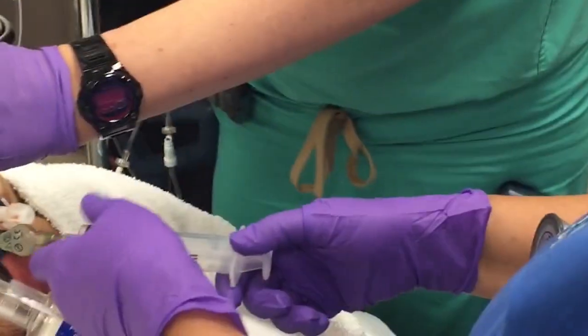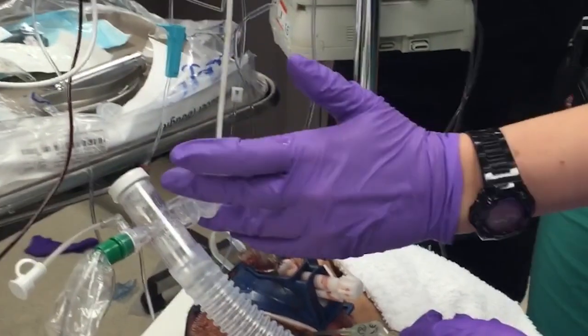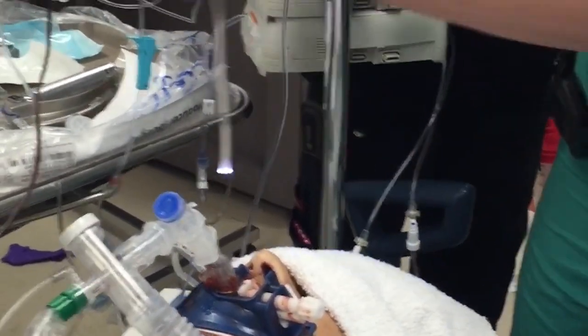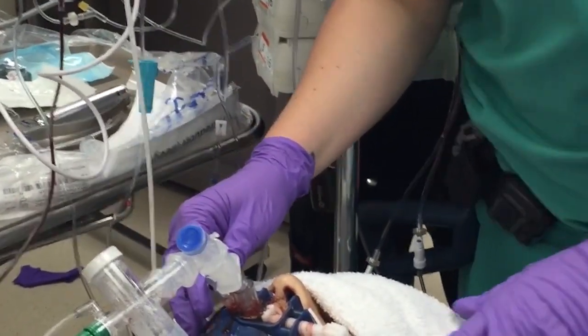You're good. Take your scope out. We're just going to continue to ventilate him for a minute. And then if we want, we can exchange — pull out the LMA and leave the tube in place.